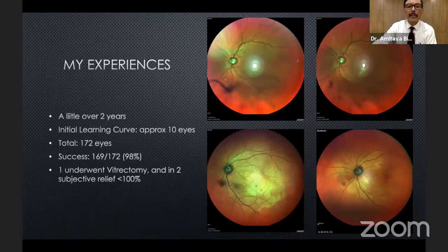One of the patients had very large vitreous opacities. This is the patient, Dr. Paul Singh, whom I had taken to you, and you had taught me or shown me the laser delivery hands-on on this patient. He finally underwent vitrectomy. He had so much of floaters.